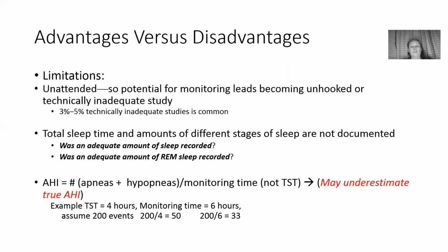So I could go through all the advantages and disadvantages of home sleep testing and in-lab sleep testing, but those are pretty obvious. I mean, cost is one, comfort is another, and so on and so forth. So I think you guys can logic that out, but let's talk about the limitations. The limitations of an unattended sleep study, meaning a home sleep study: it has the potential for monitoring leads becoming unhooked during the study, which leads to an inadequate study.